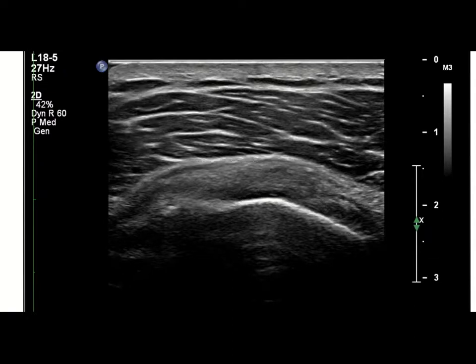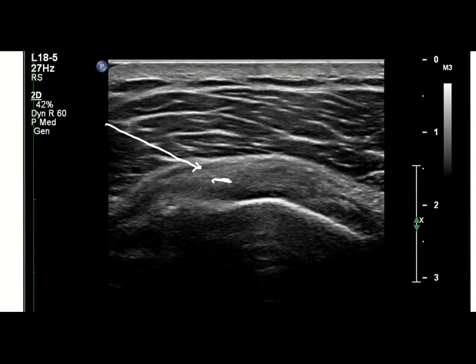For this injection, our target is going to be the subdeltoid bursa right here. Sometimes you have to really force it to dissect away the bursa — it can be quite tight. You don't really want to get into the tendon, although it will take some fluid and it will expand.